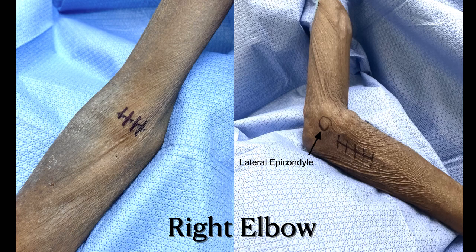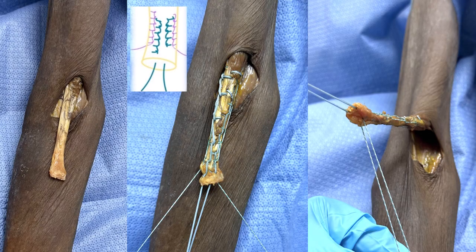First, landmarks are created. The first landmark is the transverse skin incision at the cubital fossa, and the second landmark is on the lateral elbow. It is the longitudinal skin incision at the dorsal lateral aspect of the proximal forearm, where the radial tuberosity is located when the forearm is pronated. After the transverse skin incision is made, identify the torn distal biceps, then suture the biceps.